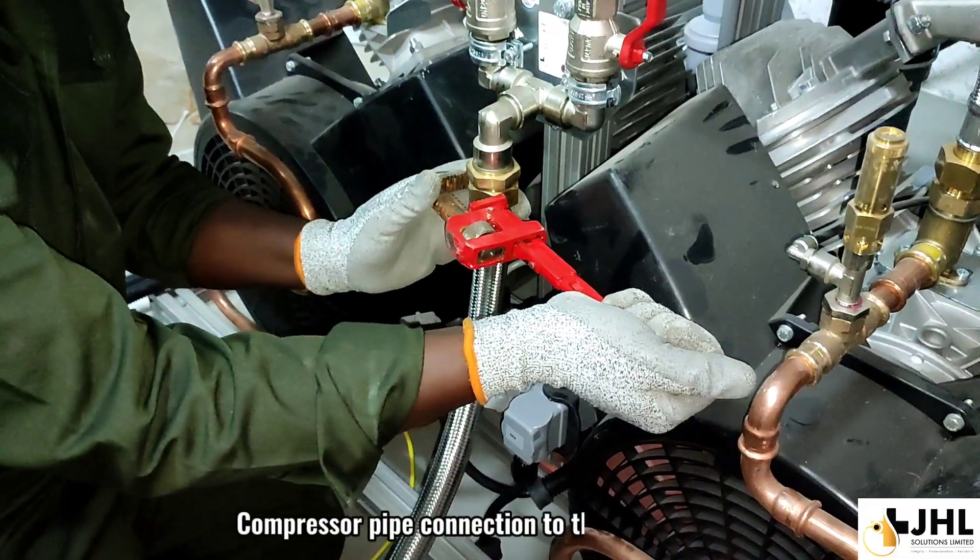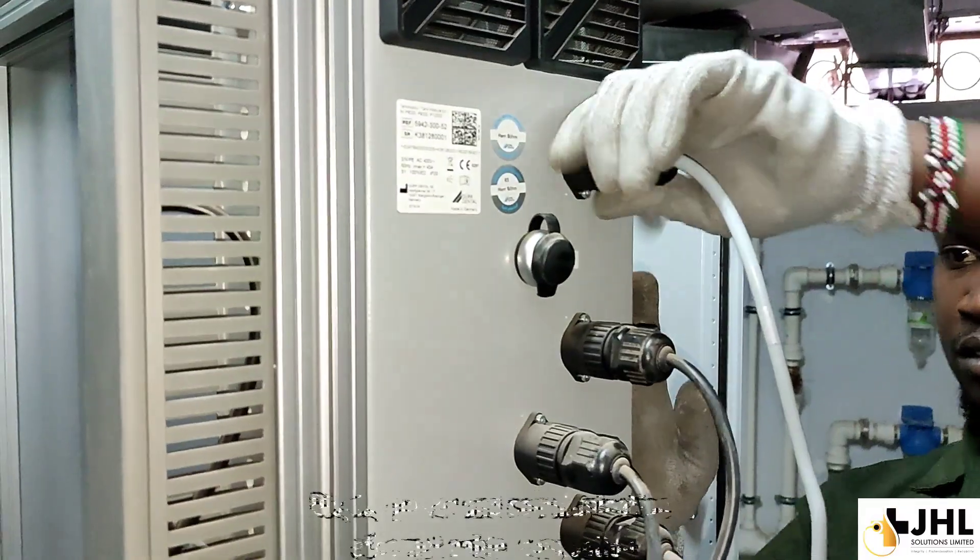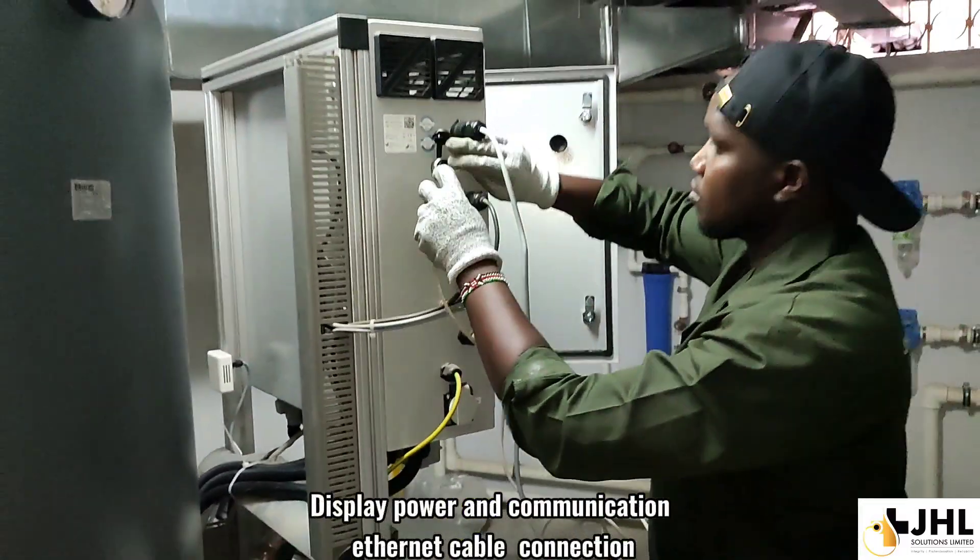Compressor pipe connection to the tank module. Display power and communication Ethernet cable connection.